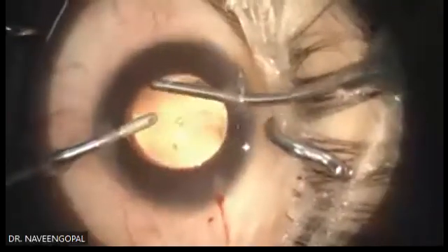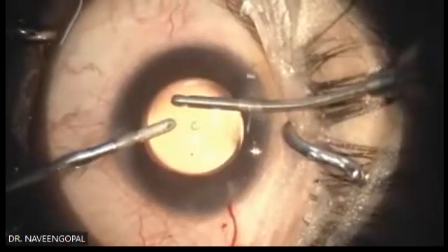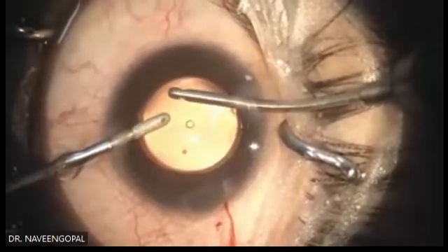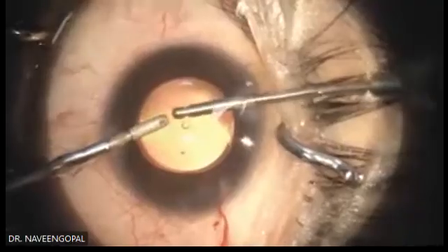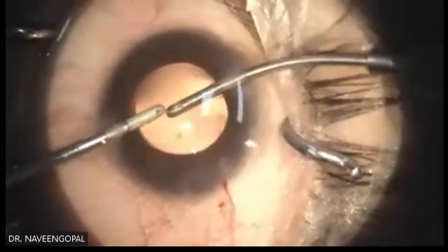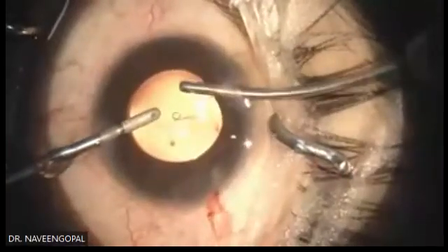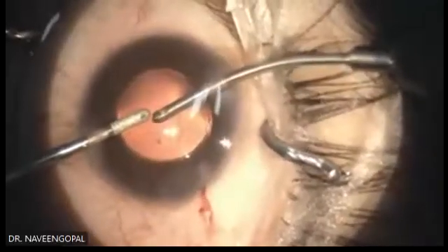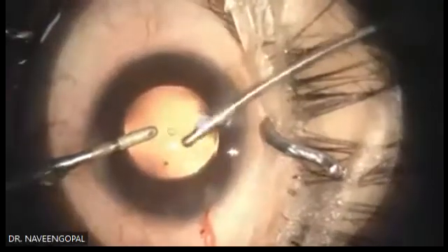I've handled all sorts of lenses, from Star ICL to Biotech ICL, from APA to IOCare, everything. BioCare gives you predictable results. APA's for me also, IOCare also, but here they have ready stocks and they give you the lenses immediately if it is spherical, and about 2 to 3 days for your toric lenses. That is a disadvantage of Biotech, what I found. And the results are pretty predictable as well in Biotech. That's why I prefer these lenses.